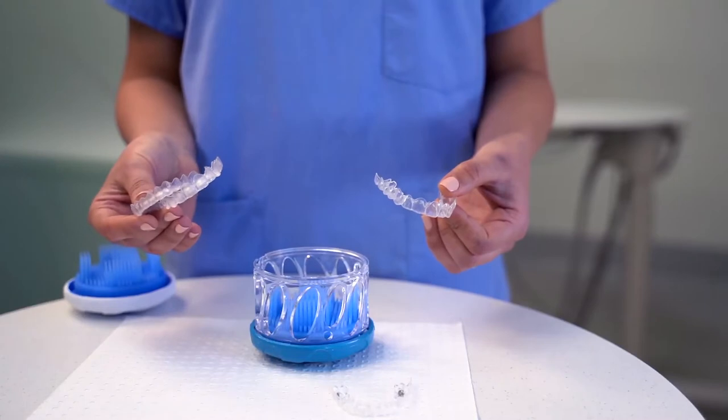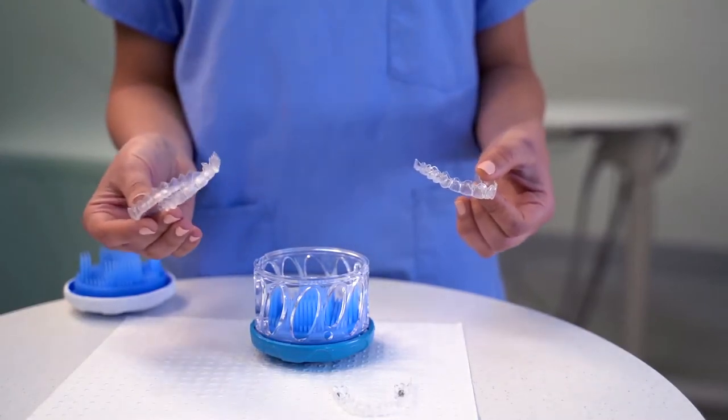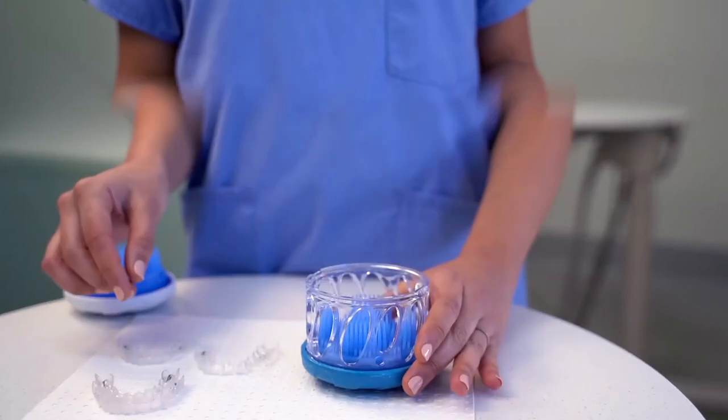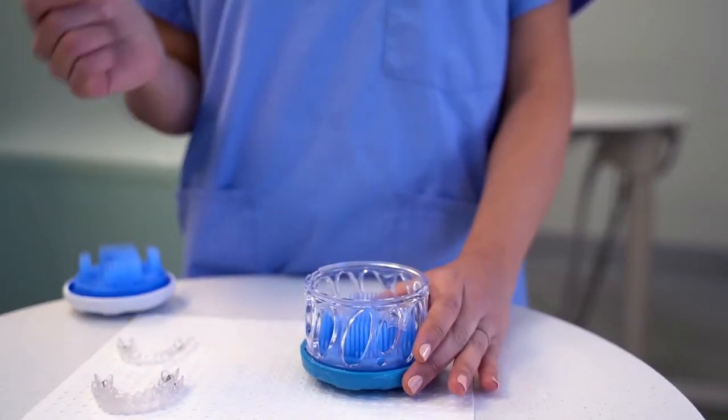For clear aligners you can wash them one at a time, or if they fit in your device, two at a time. When washing one at a time, nestle it into the bottom brush of the device.